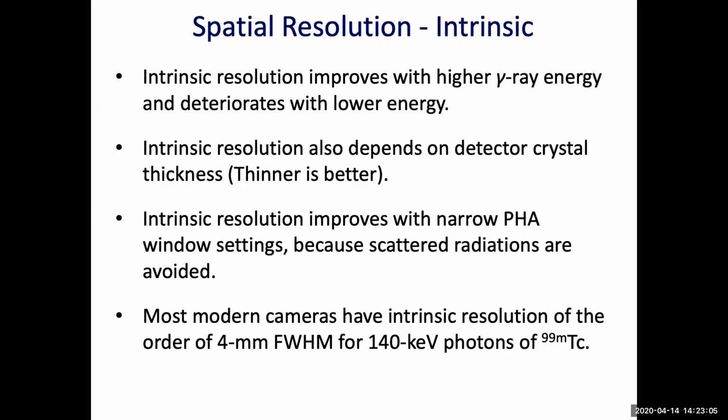Intrinsic resolution also depends on the detector crystal thickness. We already mentioned that. Thinner is better for resolution because a thicker detector results in greater spreading of scintillation light before it reaches the PMT tube and enhances the probability of Compton scattering, and this deteriorates the spatial resolution.